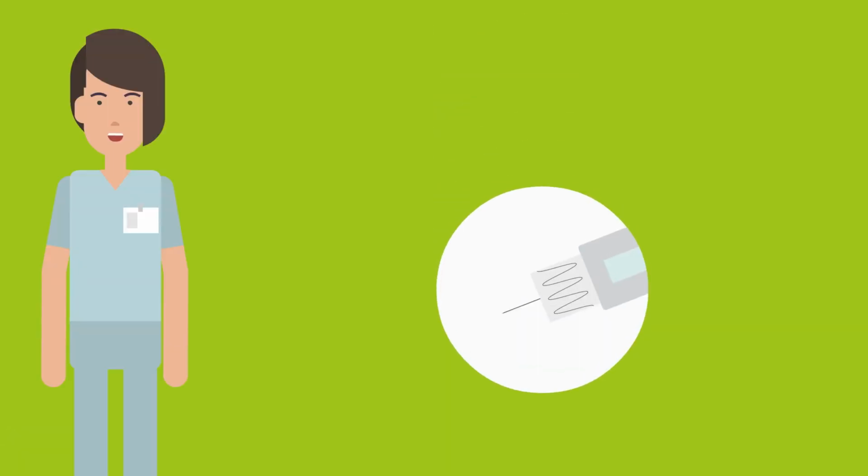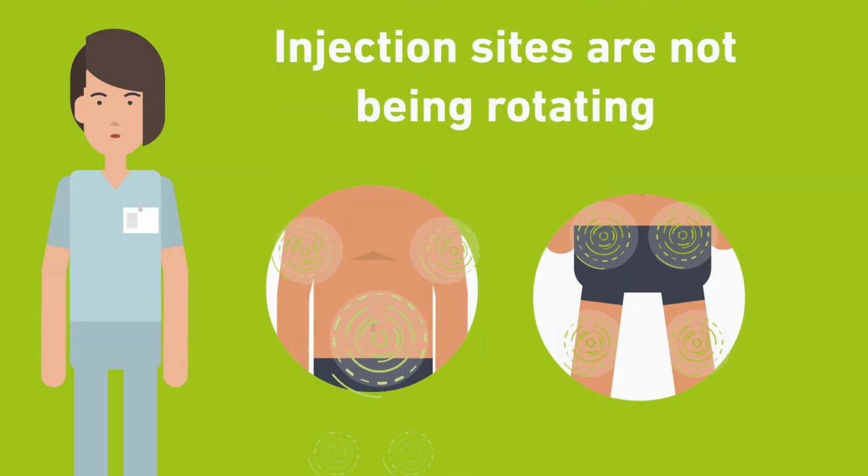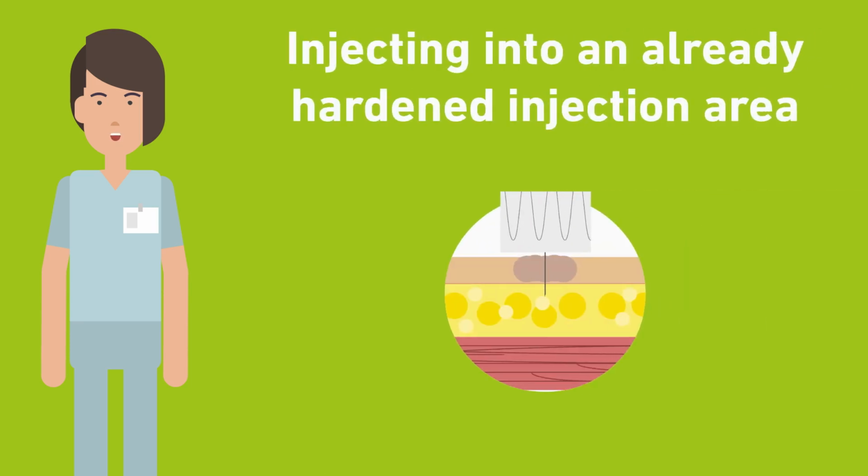Lipos can possibly be caused by reusing needles. It is important to change the needle after every injection. Other causes are injection sites not being rotated, and injecting into an already hardened injection area.